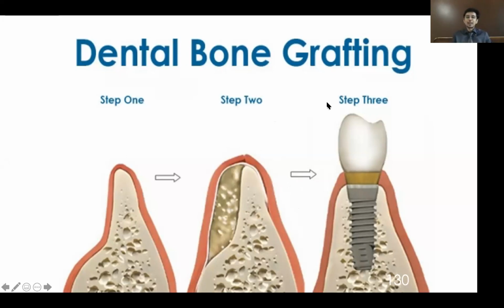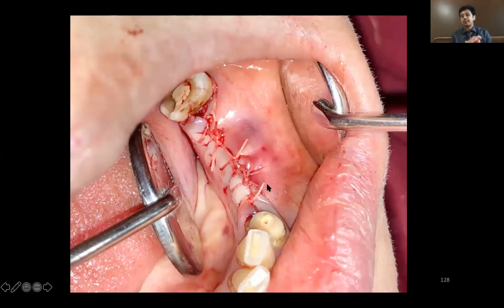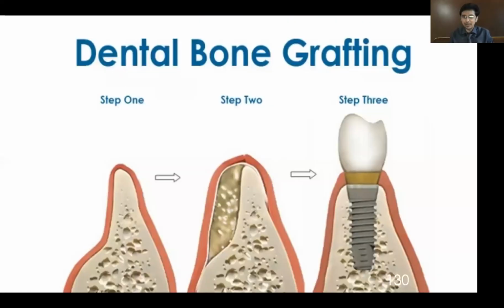What sutures? Excellent, excellent point. The sutures which I have used are one of my favorite sutures. This is undyed Vicryl. Remember Vicryl, PGA PLA suture? Dyed Vicryl is violet in color. Now that violet color suture actually resolves very slowly. It takes around 30 days or so. This is undyed Vicryl, my favorite suture which I use. Undyed Vicryl suture generally resolves in 15 to 20 days, and the color match is also very good. So I generally prefer undyed Vicryl anytime over silk. This is monofilament, hardly any wicking effect is there. So undyed Vicryl, excellent. You can ask questions in between as long as I don't have to elaborate much.